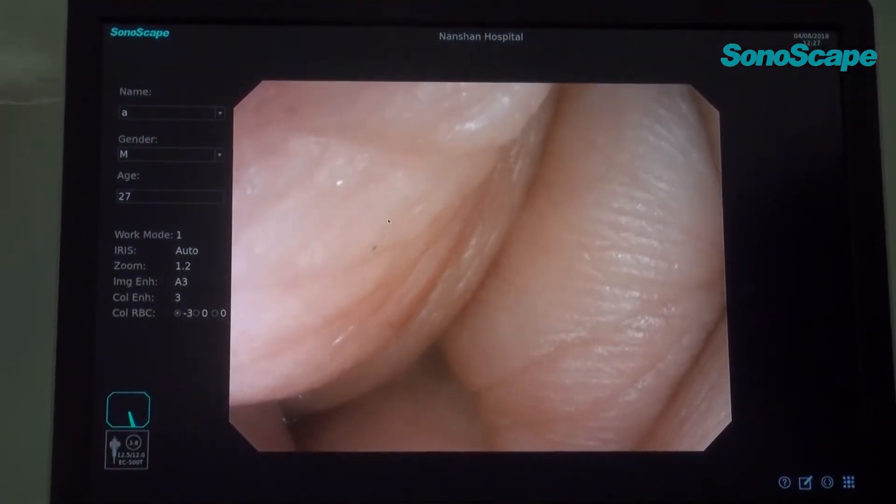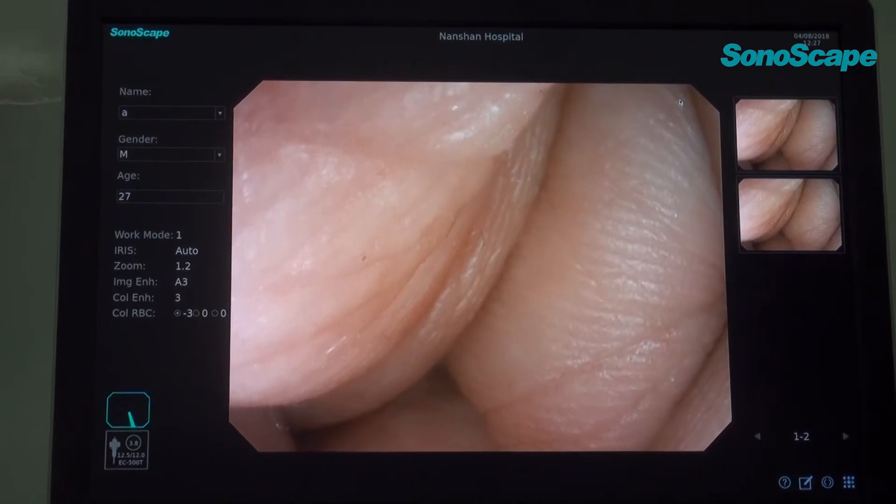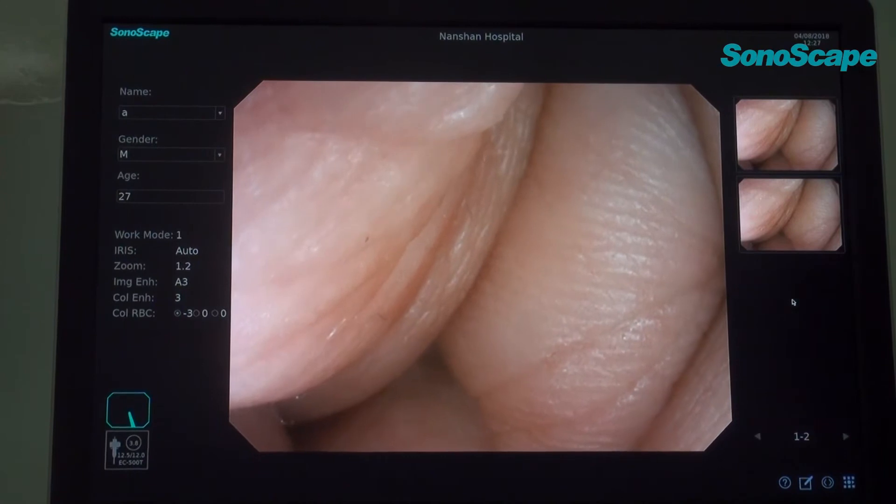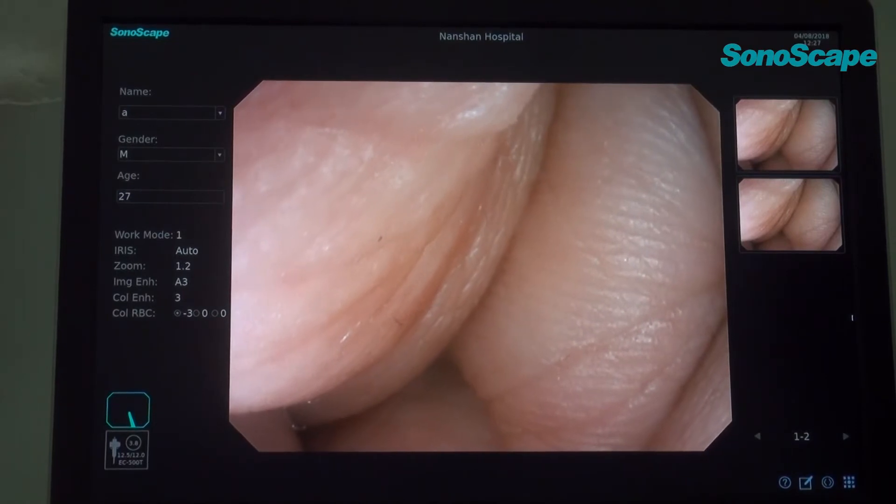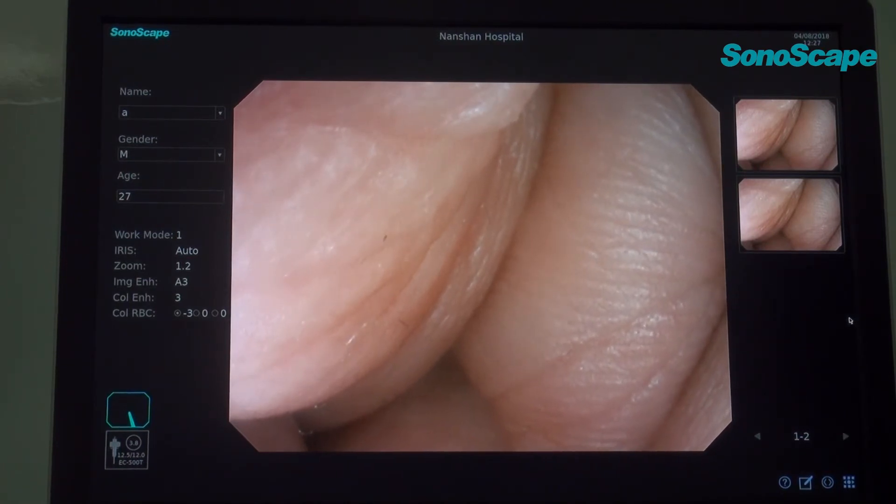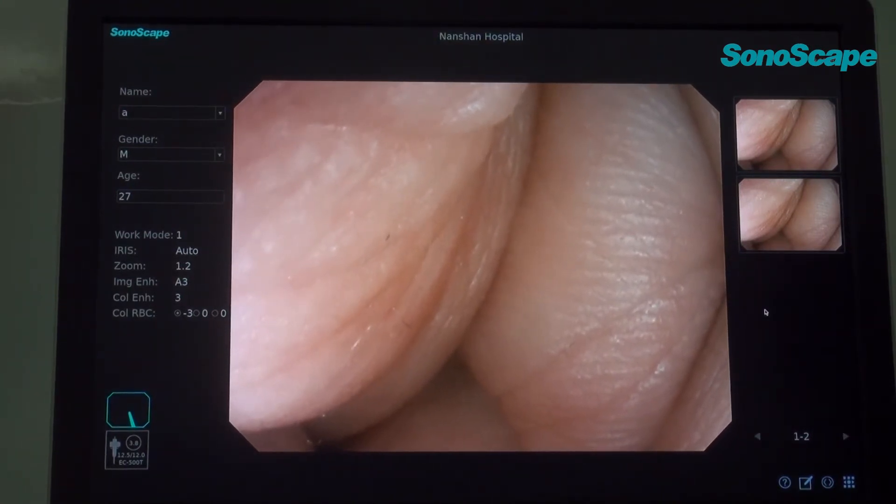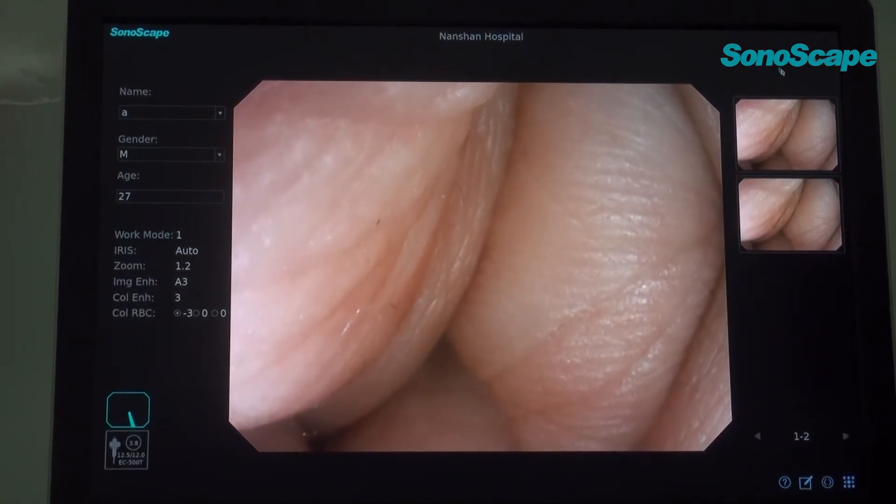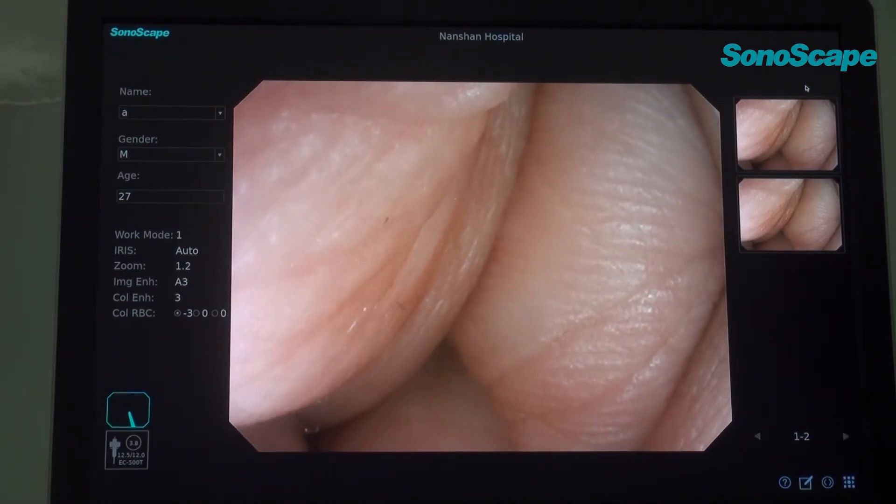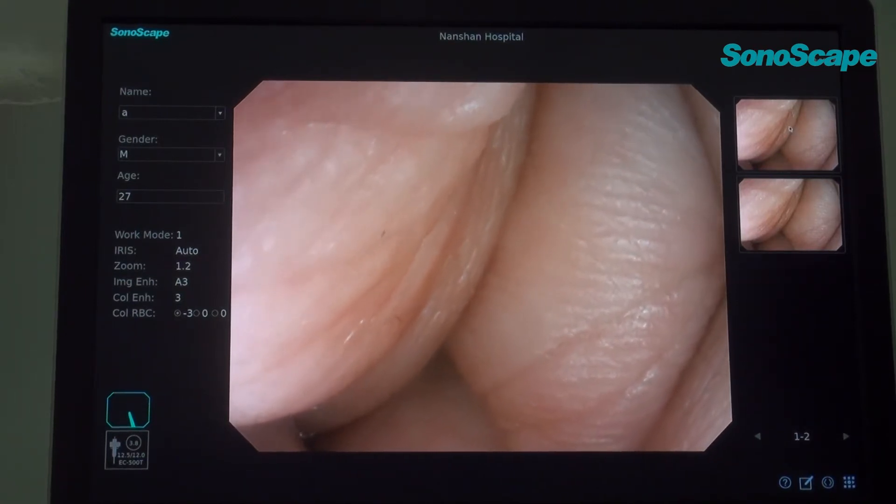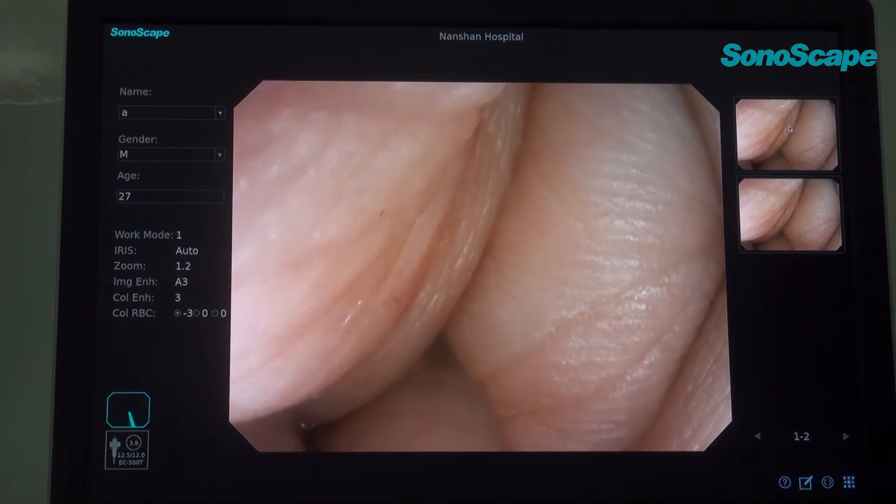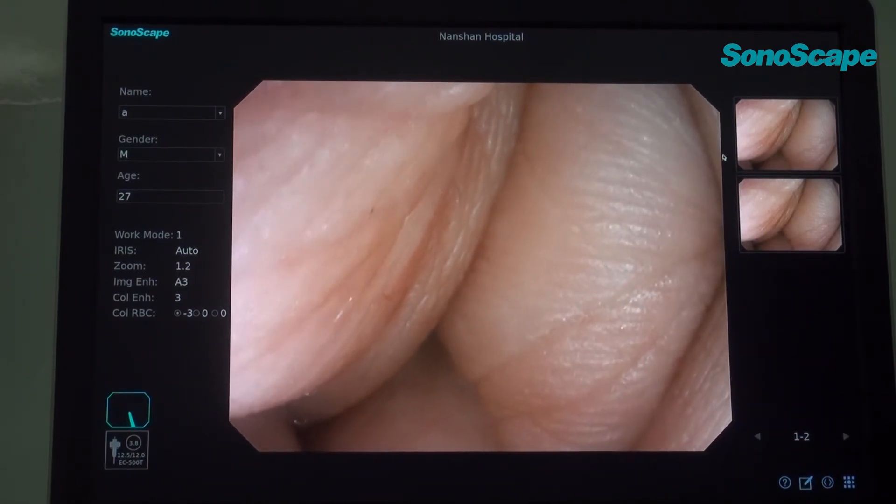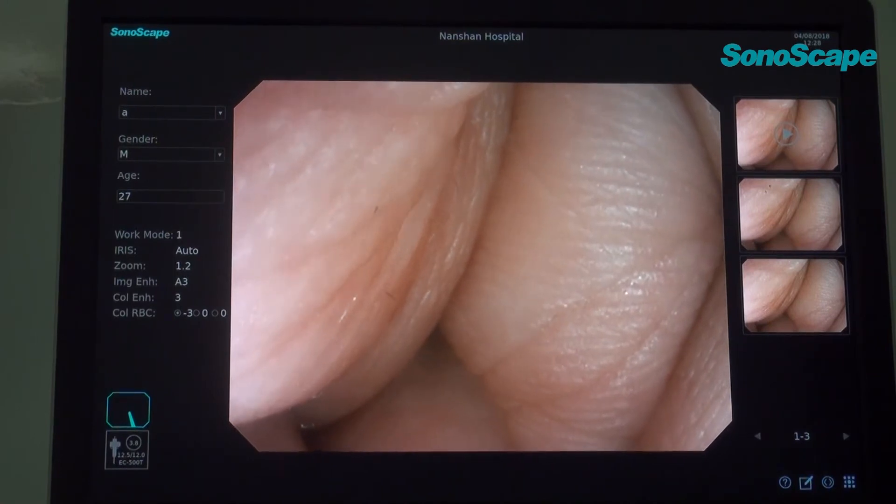And then, you do the procedure. And you save some image. Those images and videos are automatically saved in the right side of the monitor. By the way, how to record the video? In the keyboard, there are three buttons. They are record REC, pause and stop. You just press record. And then you will find in the right corner of the monitor, there is a timer to show the time of the recording. And then when you finish that, you just press stop. And do remember, the three different buttons for video recording is on the right side of the keyboard. If you want to stop it, press the stop button. And then you will find the video also automatically saved in the right side.